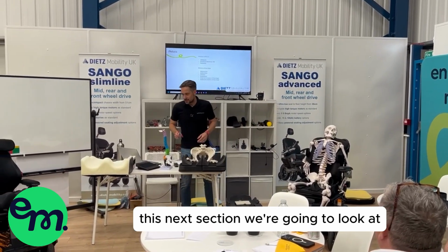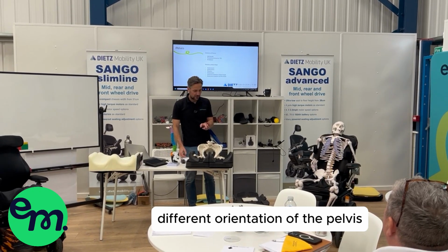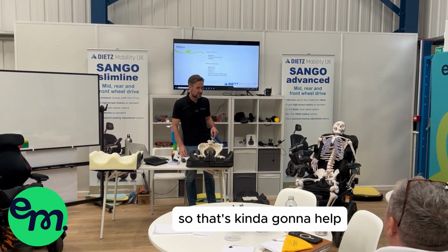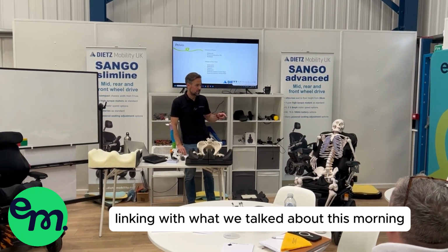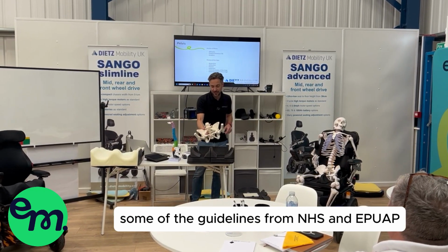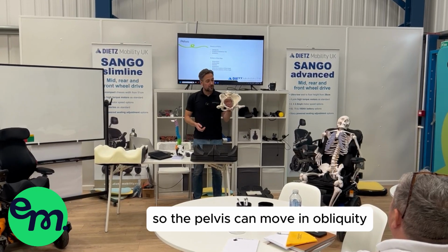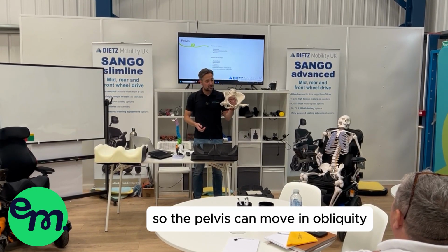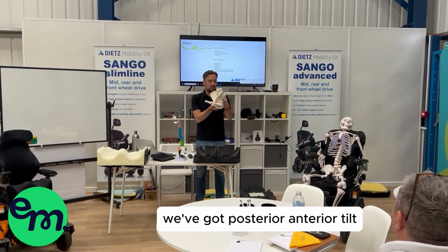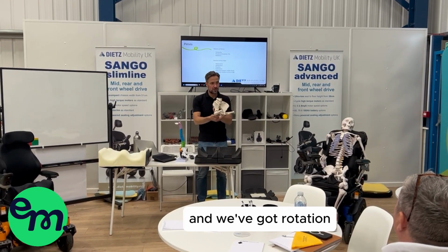This next section, we're going to look at different orientations of the pelvis, and then we're going to go into more detail with the cushions. That's going to help link in with what we talked about this morning with regards to the importance of stability and some of the guidelines from NHS and EPUAP. So the pelvis can move in obliquity. We've got posterior and anterior tilt, and we've got rotation.